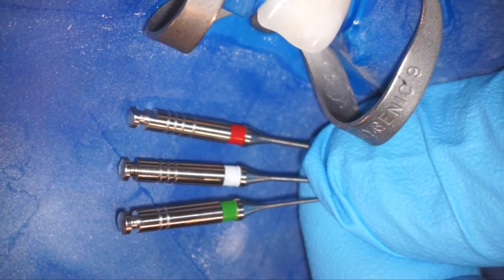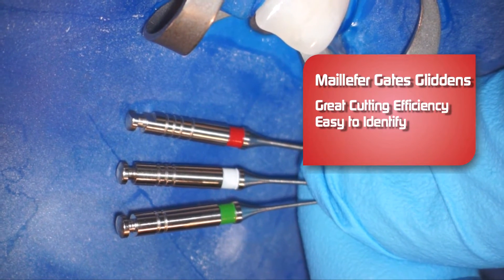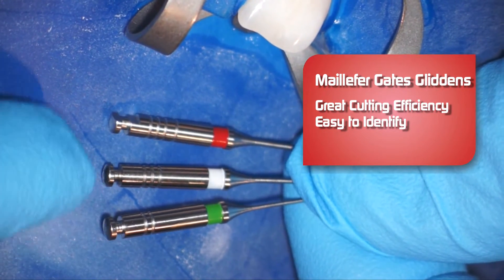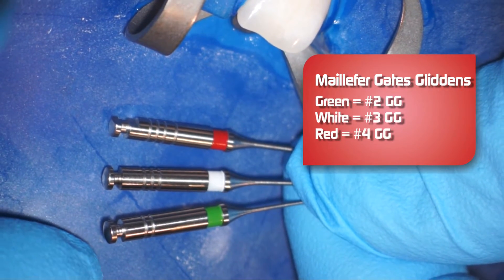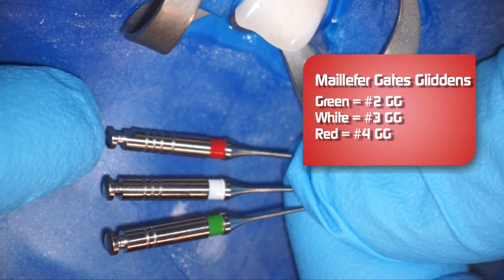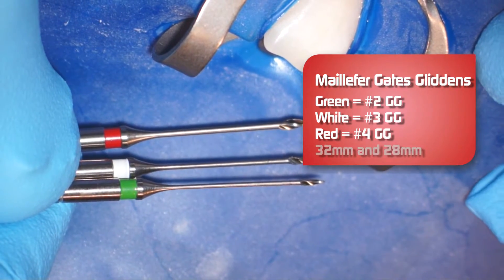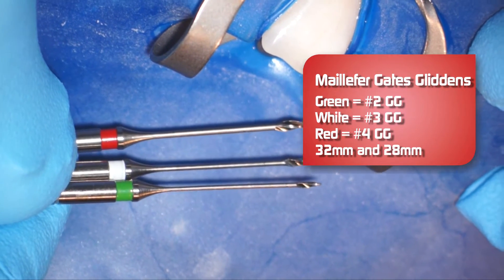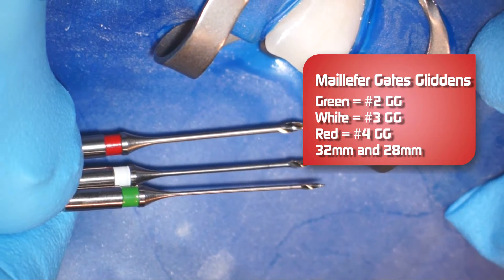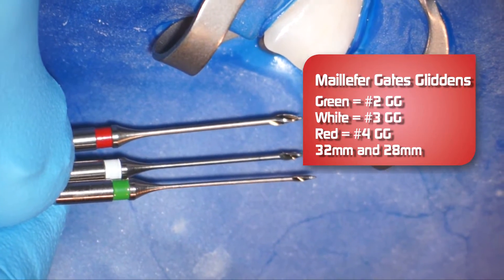Now we're going to introduce Gates Glidden burrs into the tooth here. We're going to be using the Dent Supply MyFair Gates Glidden burrs, and what I really like about these burrs is their cutting efficiency. They're very easy to identify — we have our markings at two, three, and four, and that lets us know the size, so even though it's in your slow speed latch attachment, you can still see the color and know what size Gates Glidden you have. We are going to use the 32 millimeter length Gates Glidden in this tooth because our measurement is 23 and a half millimeters, and I want to be able to use the full length of the Gates Glidden. They also come in 28 millimeter length for shorter teeth, but for this tooth, the 32 millimeter is appropriate.